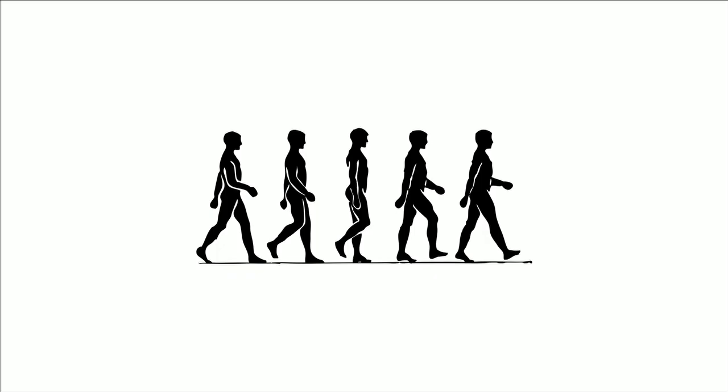walking is the basic locomotion of the human. We walk to move from one location to another. And we push off the ground using the ankle. More specifically, we use the muscle to push off the ground to move the body forward. But a conventional prosthetic limb cannot do it because they're all passive. They don't have any muscle at all.